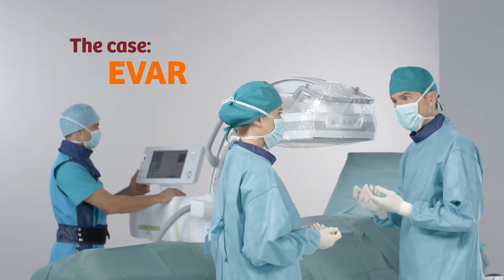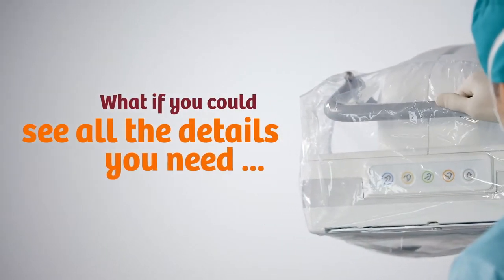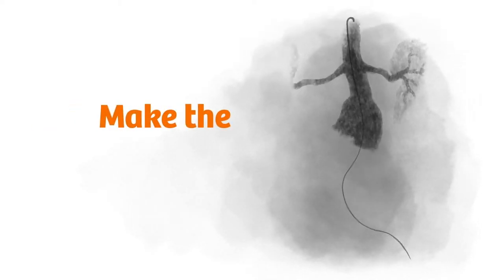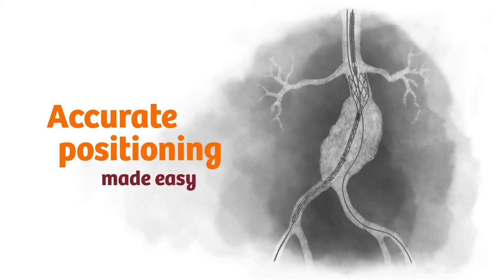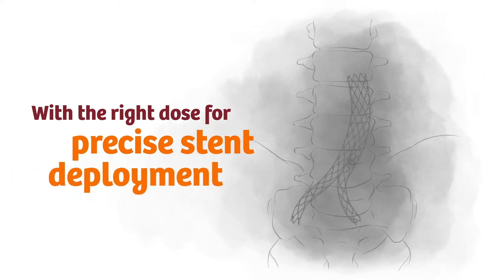When it comes to challenging procedures such as an EVAR, what if you could see all the details you need with the right dose for the situation? Subtraction angiography makes the invisible visible with the right dose. Easy switch to road mapping for accurate positioning with the right dose for precise stent deployment.